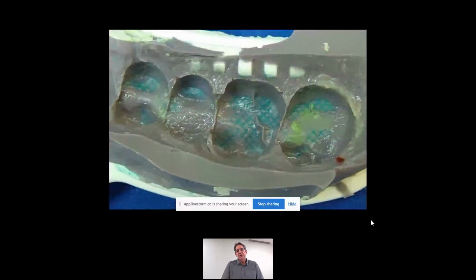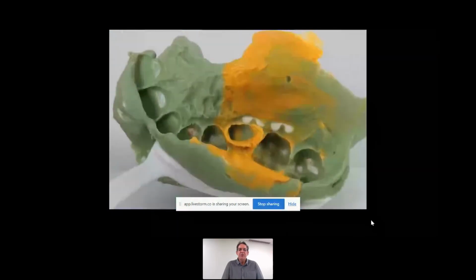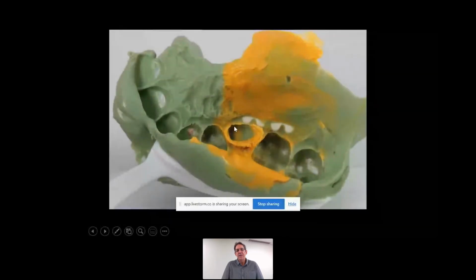In this situation, the patient has clenched down too hard. So here you can see the mesh is exposed through this. So for the occlusal and lab to create something that's going to go into perfect occlusion is extremely difficult. Here, the arch width of this plastic tray is too narrow, so you can see that it's compromised the impression right here on the margin, because there's the tray wall of that plastic tray.